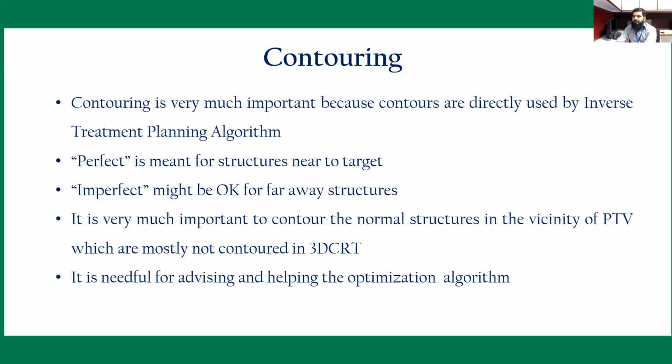Contouring is very important because whenever you use plans for IMRT or VMAT, it is directly linked to the treatment planning algorithm. So near the structures, we should have perfect contouring, although we can compromise if the normal structures are away from our target structures or they are not in the beam.